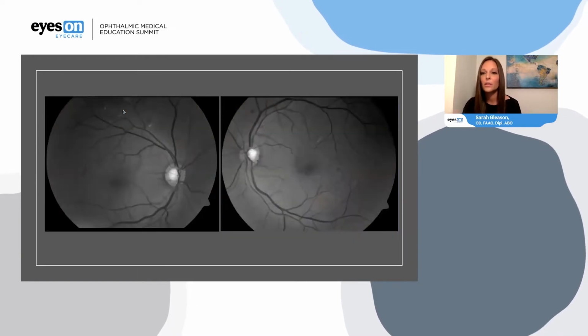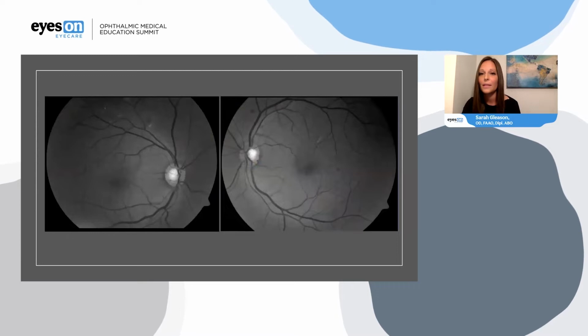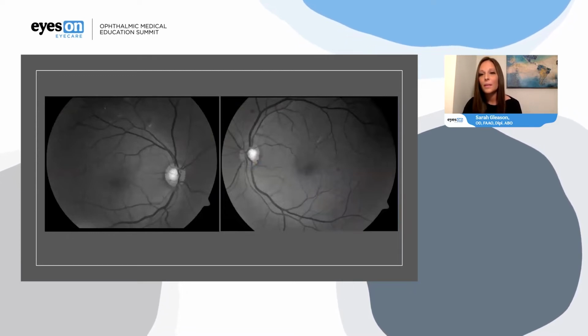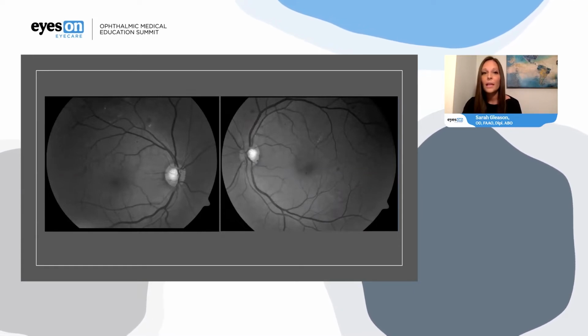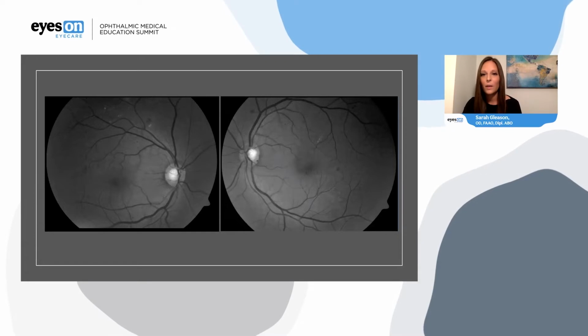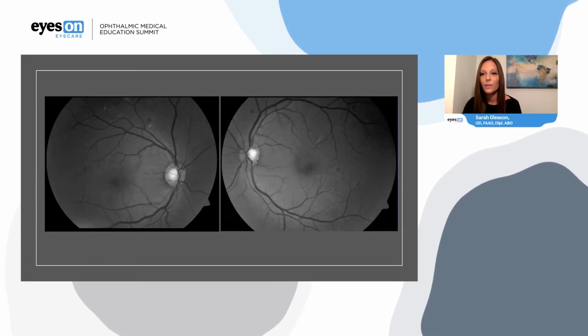So sometimes I like to do red-free photographs in these cases, especially if the retinopathy is a little more subtle or if the exposure wasn't just right on the color photos, because it really highlights those areas of hemorrhages even more and the areas of exudation as well. And you see that highlighted here in the red-free images.